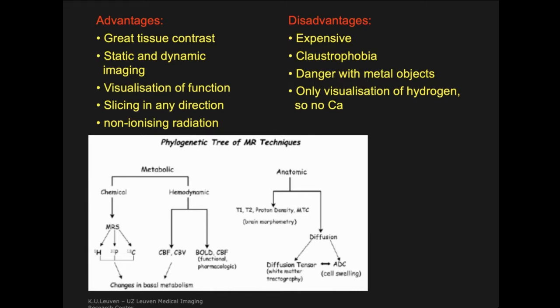Okay, so it is not a safety concern, but more an effect on the information in the image. Yes, it will for sure cause artifacts. So the more implants you have, the more artifacts around that part. So sometimes you cannot see it, but there are very few implants that would cause problems with the scanning. Because a lot of implants are based on titanium, for example, and titanium doesn't cause safety problems indeed. Okay. Thank you very much.